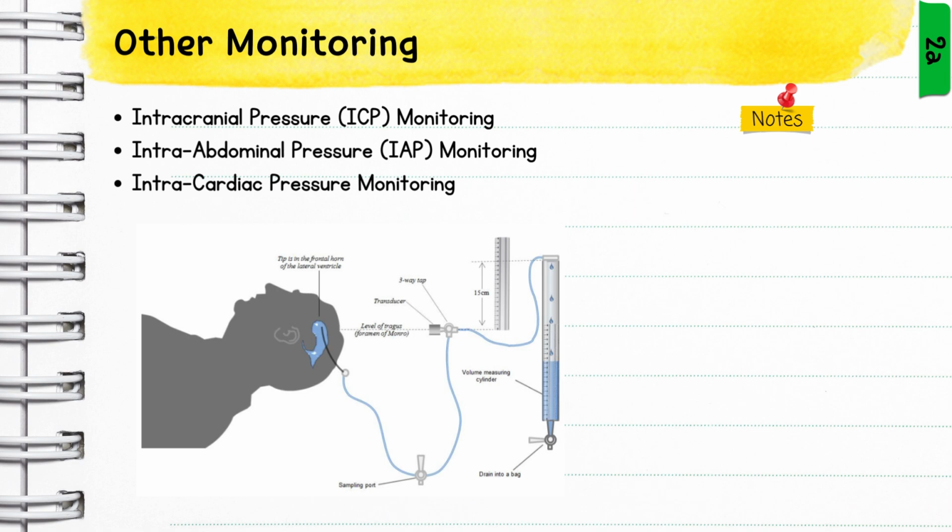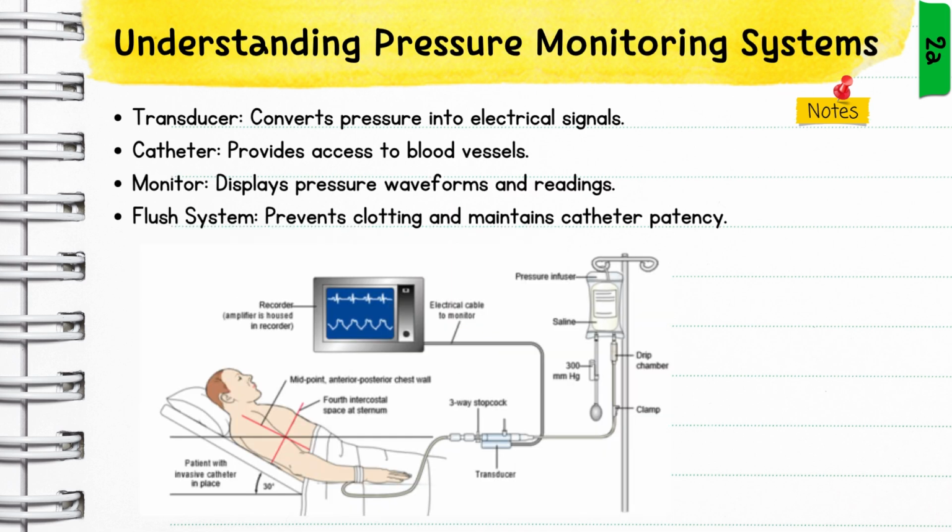So if you want to work ICU or cardiac cath lab, which are super interesting places to work, you'll be more in tune with these. It measures the pressure within each of the heart chambers. That helps the care team diagnose and manage more complex, specific heart conditions. So just know what those are, just general terms.